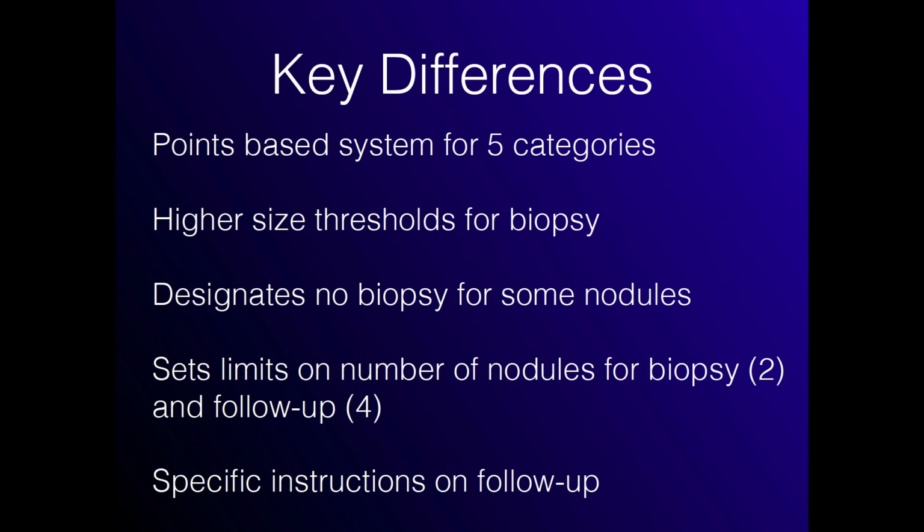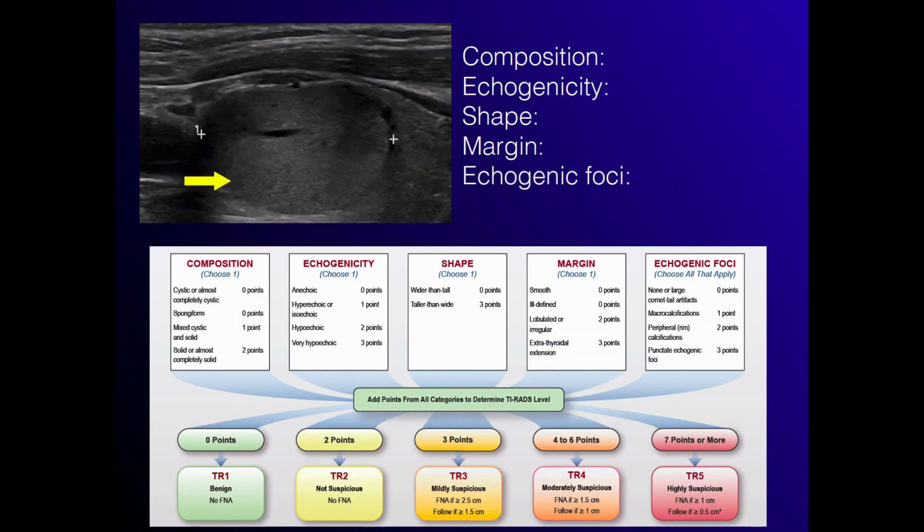And then it has specific instructions for follow-up, whereas previous guidelines just mentioned follow-up. With ACR TI-RADS, there's a strict, well, they're not strict, but some specific guidelines on how to follow up.